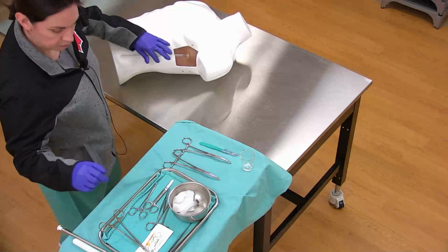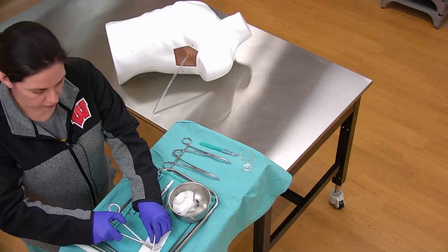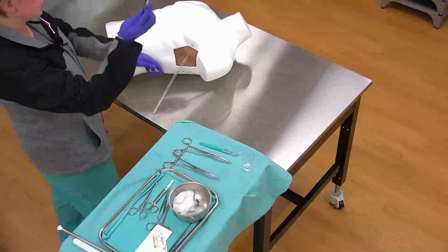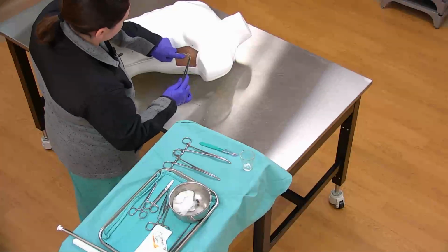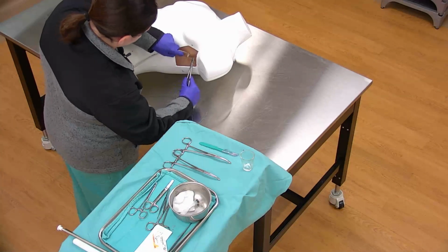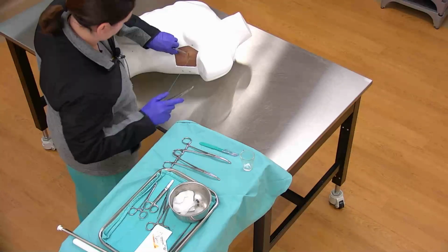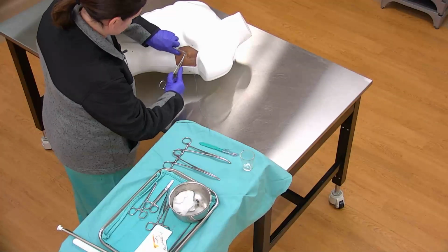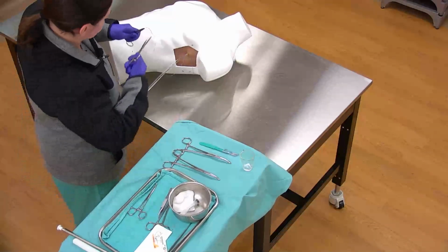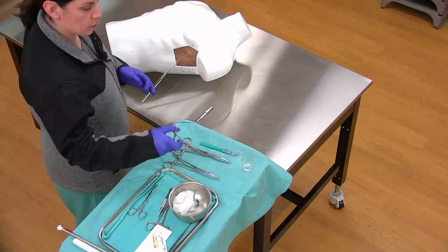And the last step is to secure your chest tube in place. There's many ways of doing it, and therefore there's not one right way of doing it. The key is that it truly holds your chest tube from slipping, and that it's airtight around the chest tube so that air does not leak around the tube. In the trauma bay, needle sticks are common, so dispose of your needle quickly after going through your skin.